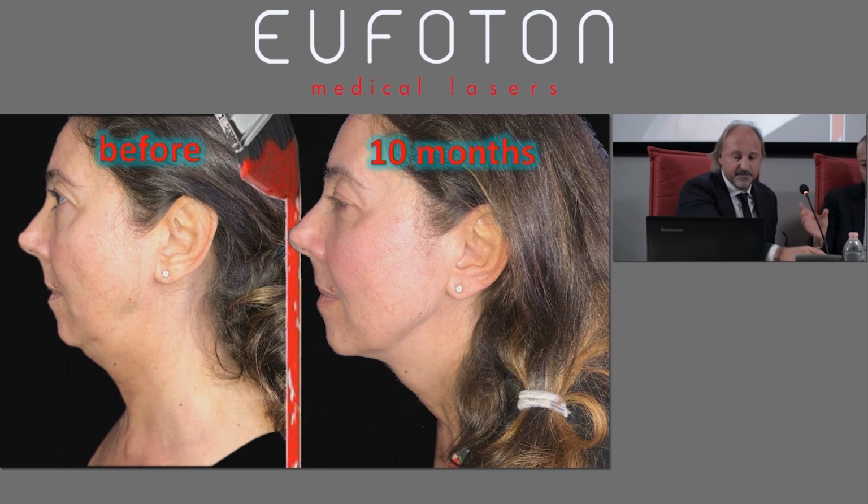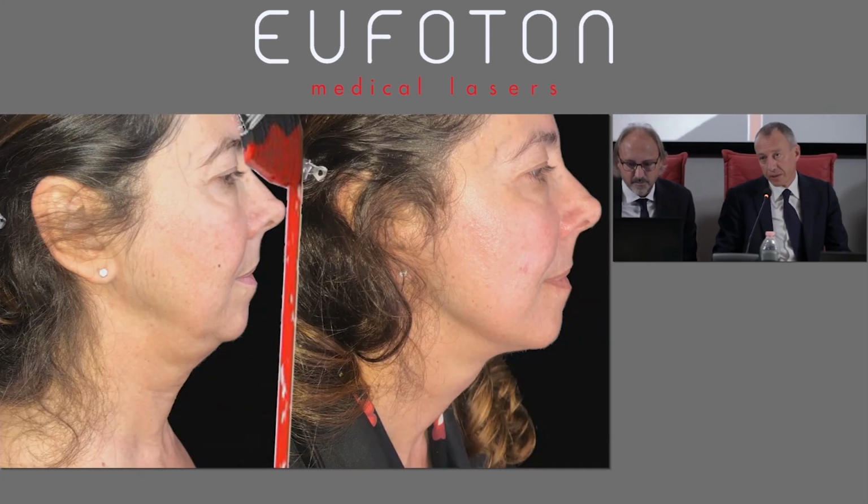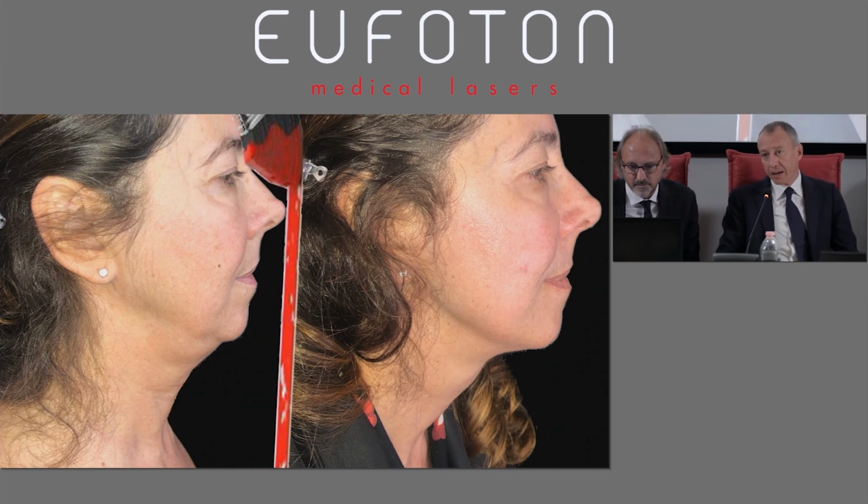The barcode, yes, that's a special, very sensitive area. It's the only area where I don't like to do anesthesia with Endolift. For the barcode, I would suggest some local anesthesia, and then the fractional laser in the same session, or after a few days, after a few weeks. Then I just supplement with Botox or hyaluronic acid according to the type of wrinkles.